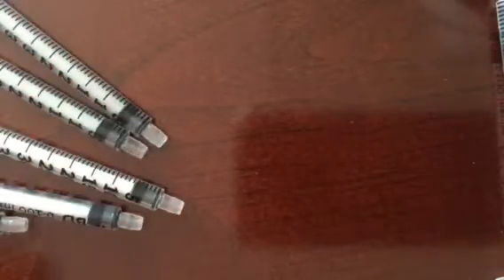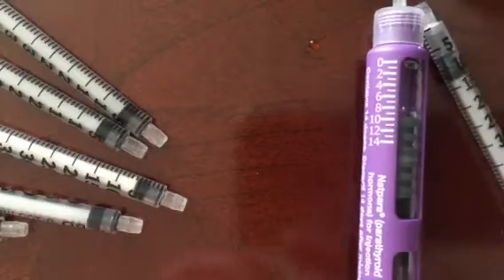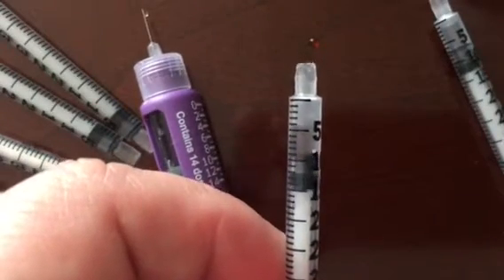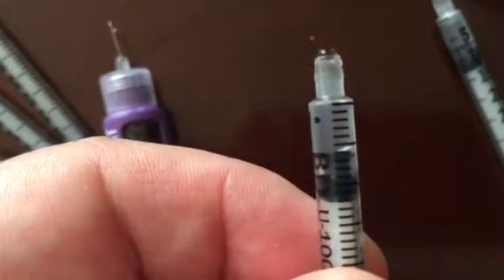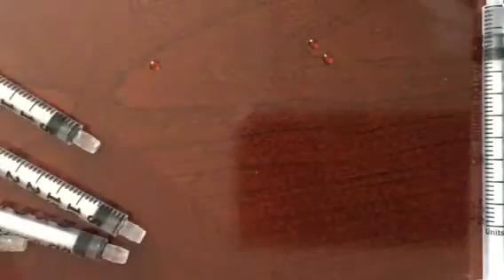So day 4, or dose 4. Push all the air out. There's air trapped in the bottom. There we go. Drug right on up to 1 there. And as you can see, 5, 6. So 2 days I got 7, 2 days I've gotten 6. I'm not feeling real good about the accuracy of my pen.